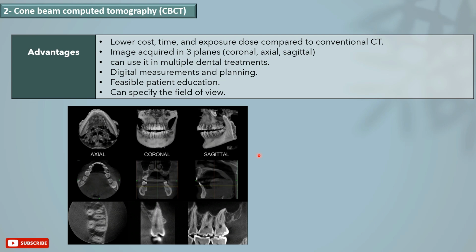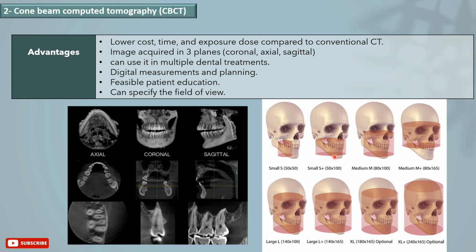It is so feasible for patient education as it is a 3D image. And of course, you can specify the field of view that you want to image before taking the radiograph. And that is important because the smaller the view, the lower the dose to the patient.